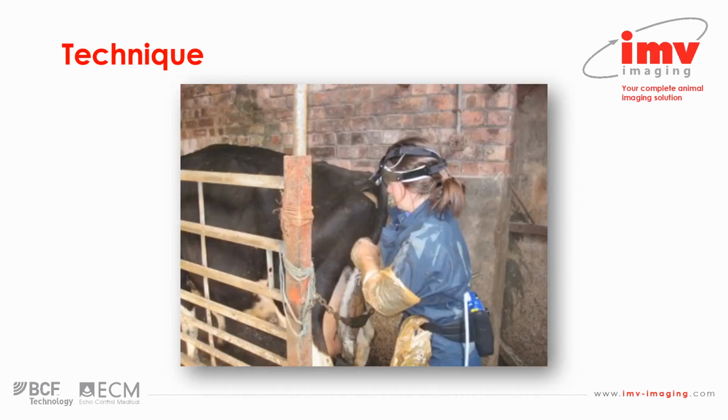So here we can see a veterinarian, typical setup for the UK at least, where we have an animal confined within a space, or just a gate up against the wall here, maybe the end of a race or a cattle crush as well, a chute to use the US terminology, and then we've got some kind of mechanism to stop the animal shooting backwards and squashing the technician or the veterinarian, in this case a chain, maybe a bar there, and then you're free to take hold of the animal's tail, obviously wearing adequate personal protective equipment here in the form of waterproof coveralls and arm length gloves.